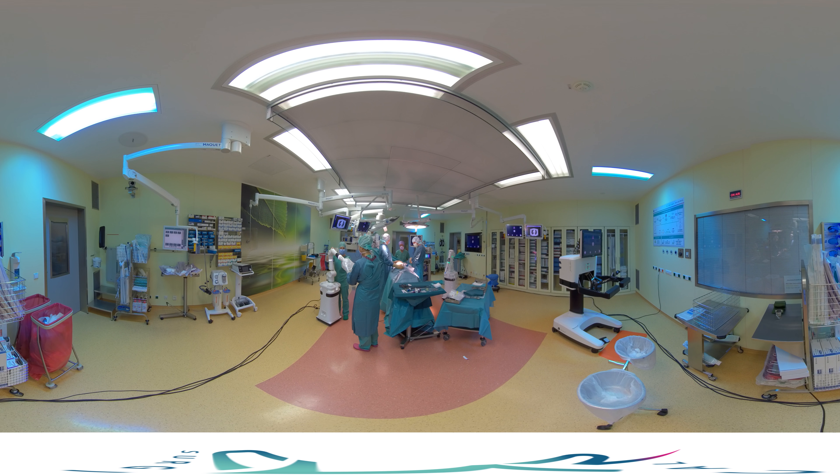You can now see the patient draped in the middle of the theater and our scrub nurse draping one of the robotic arms. This is a procedure that usually takes just a few minutes for the entire setup of the robotic arms. For this procedure we are going to use three robotic arms: two instrument arms, and the third one will control the 3D endoscope.